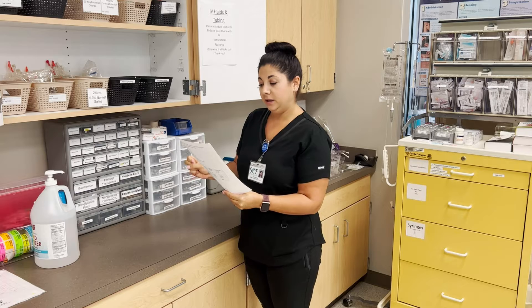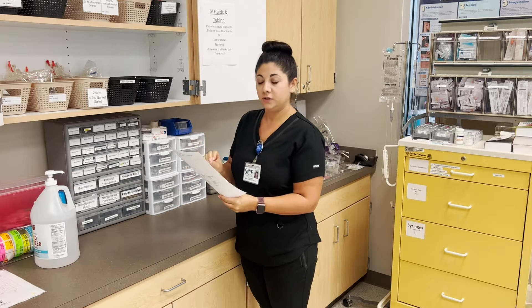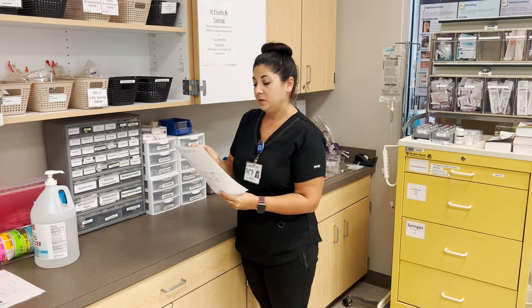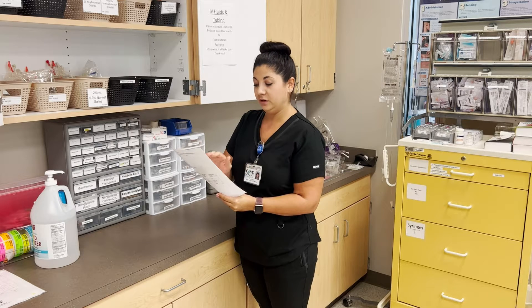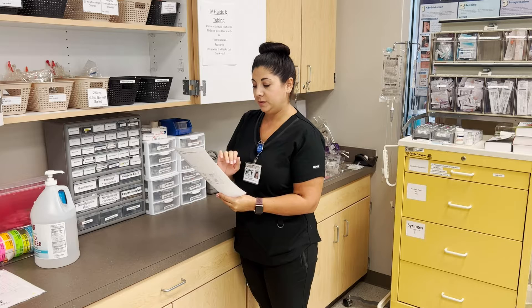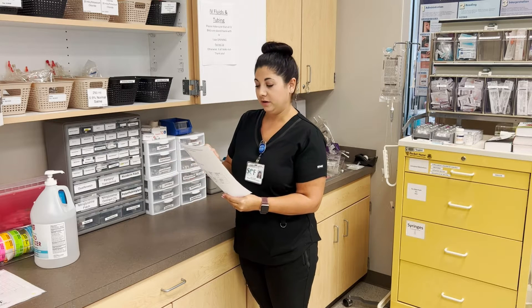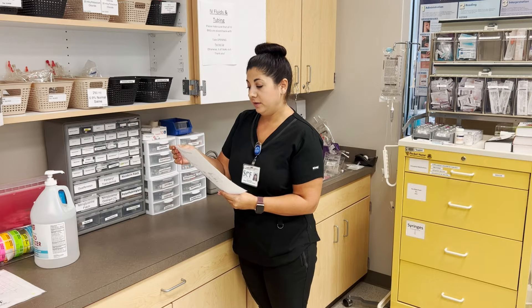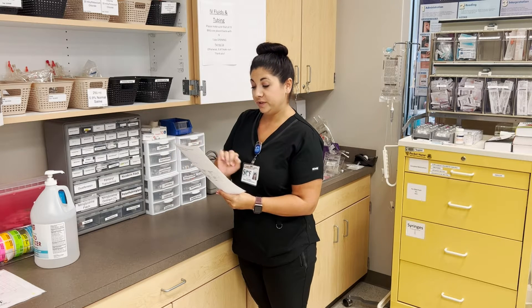Once I have what I need for each medication individually, I'm going to compare it against my MAR. I'm looking at the medication name, the dose, checking the expiration date to make sure they are not expired, and making sure that the route is correct.